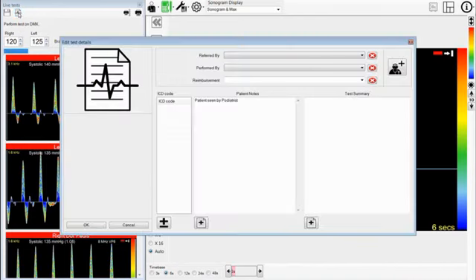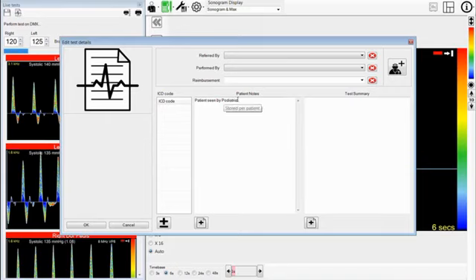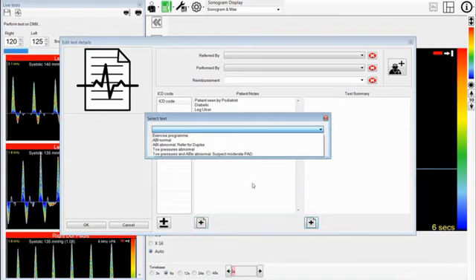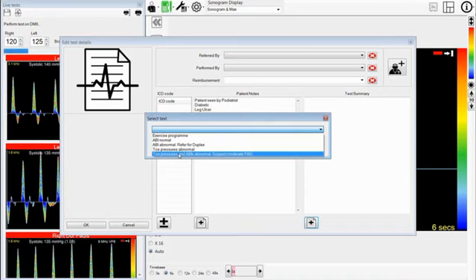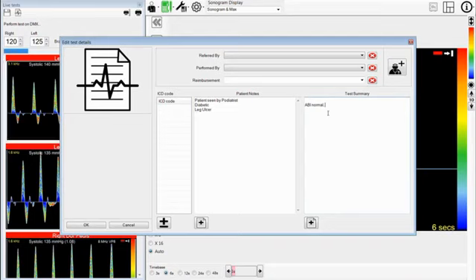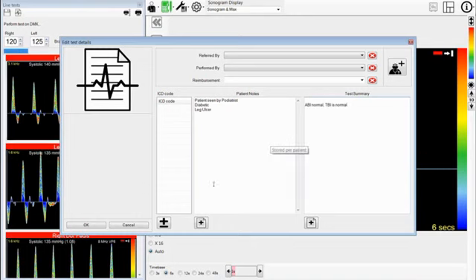Here we can now edit the test details. The patient was seen by the podiatrist, but we can add in now that they were diabetic and that they also had a leg ulcer. On the test summary side, we had previously entered information and now we can add in that his ABI is normal and TBI is normal. Press OK, then save the changes to the database.